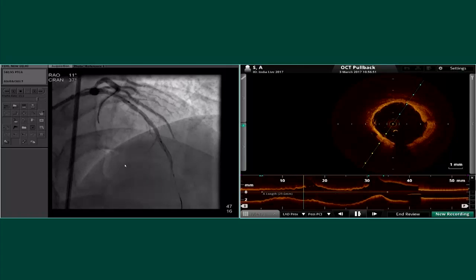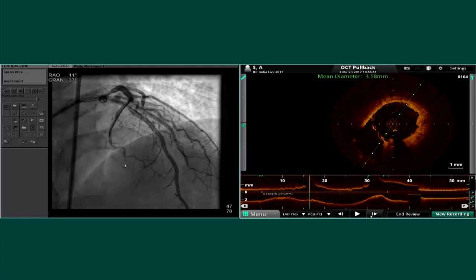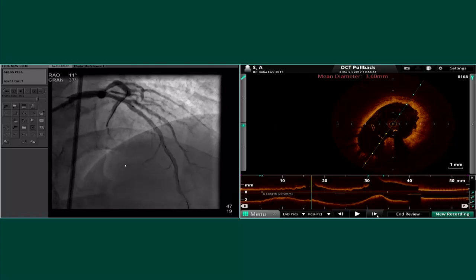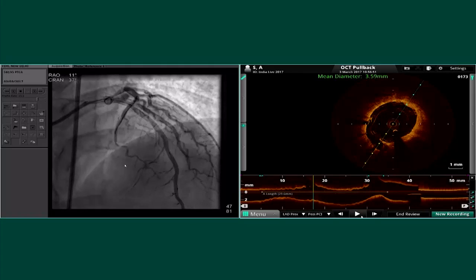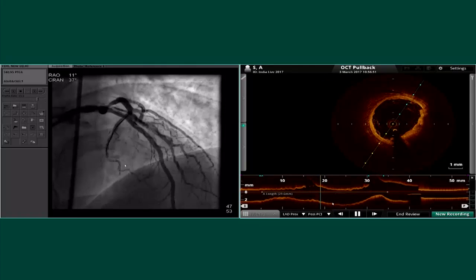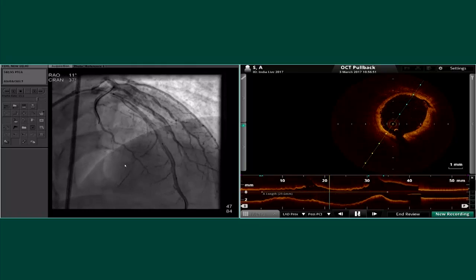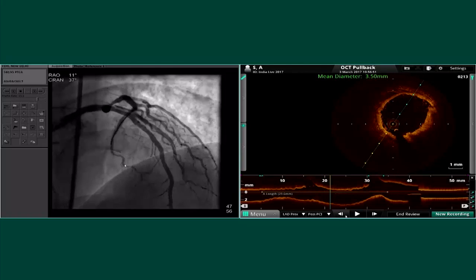We're coming to that diagonal. Now just stop at the diagonal. The ostia of the diagonal doesn't look bad. Looks perfect. So I think it will remain patent. Yes. And then as we come backwards, we got a large vessel out here. So don't go slowly. I'm showing you that the struts are embedded here.